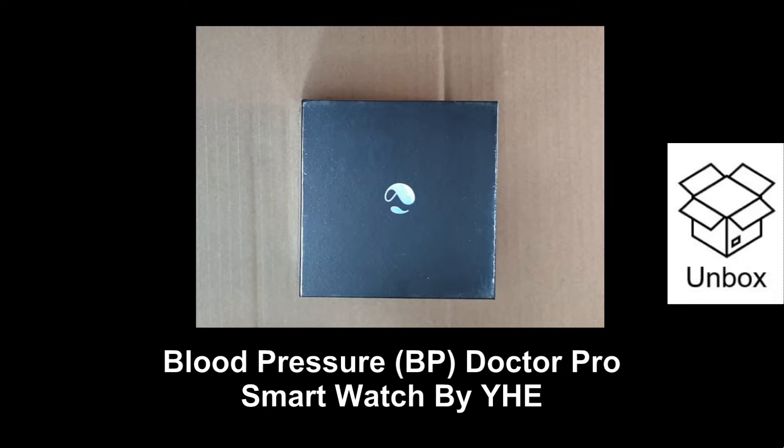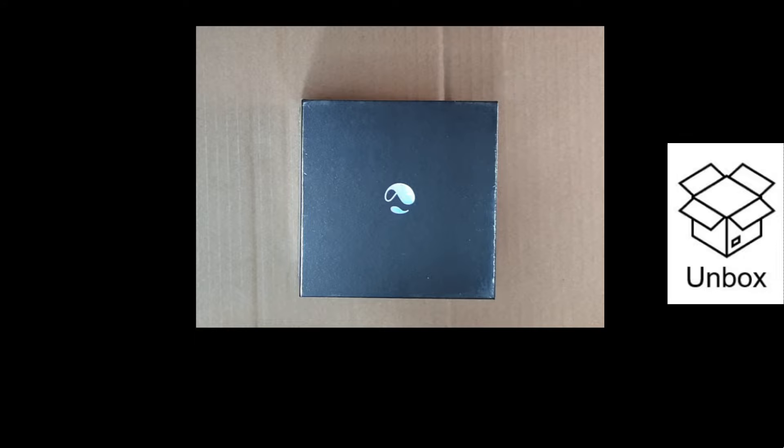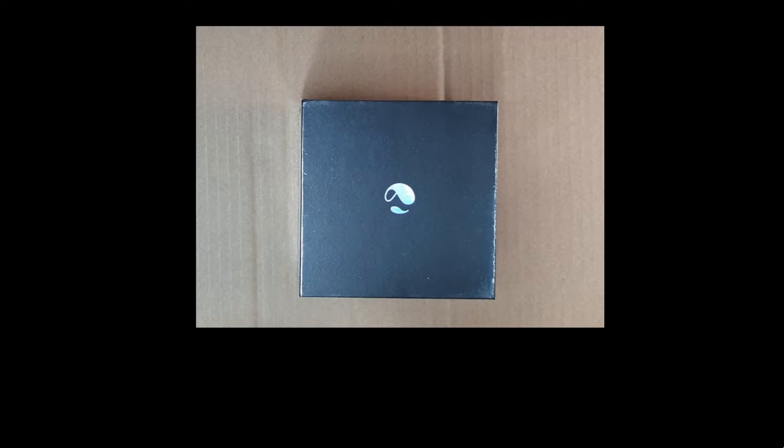This is the BP Doctor Pro, a blood pressure smartwatch by YHE. We're going to unbox this smartwatch and set it up for use. Specifically, we will focus on the blood pressure accuracy and show you how to take blood pressure wearing the smartwatch on your wrist.